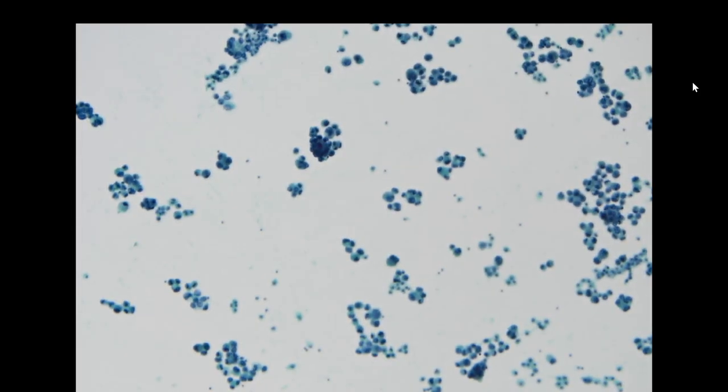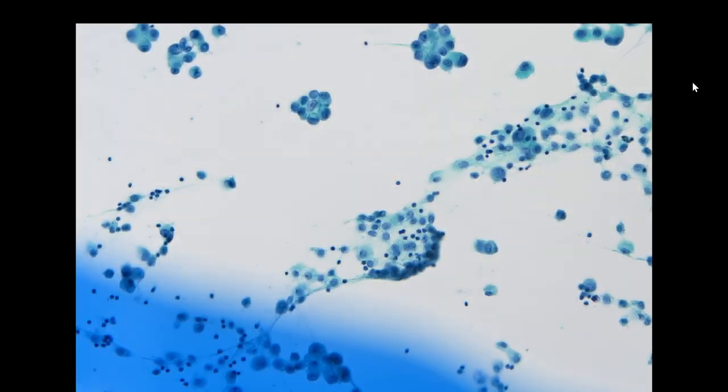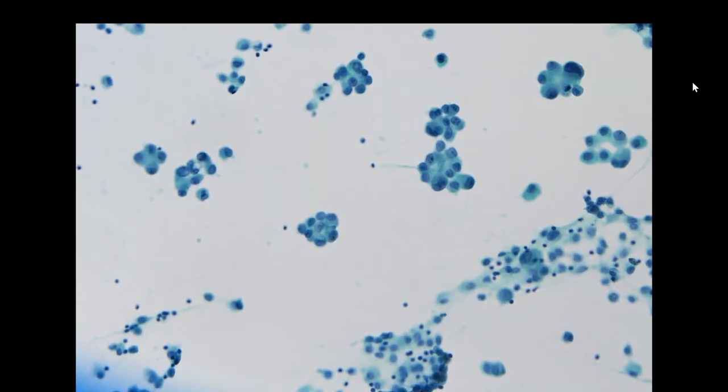So again, this is lung pleural effusion metastatic adenocarcinoma, and a different case with very similar presentation. We have this type of specimen very frequently, so it is basically not a big problem to us.